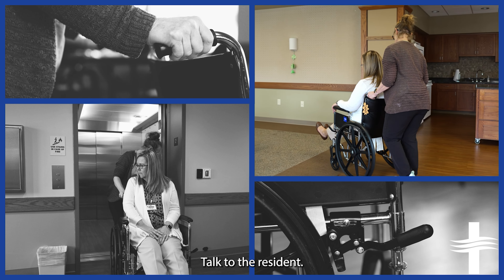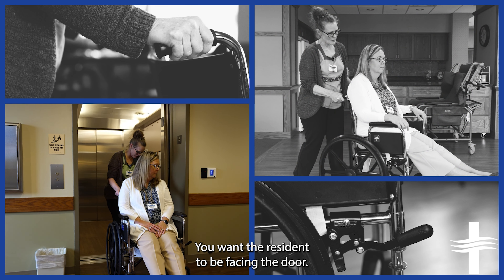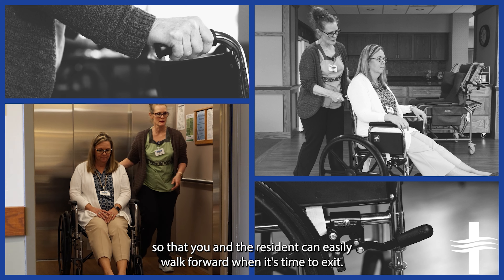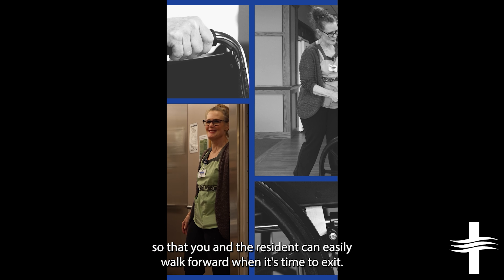Walk slowly and enjoy the journey. Talk to the resident. Take time to stop and look at things of interest. When entering an elevator, you want the resident to be facing the door they will be exiting from. Many times that will require you to back onto the elevator so that you and the resident can easily walk forward when it's time to exit.